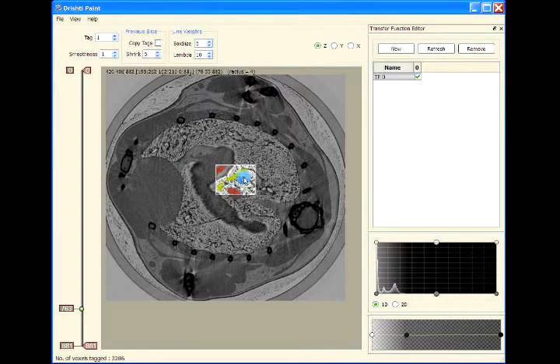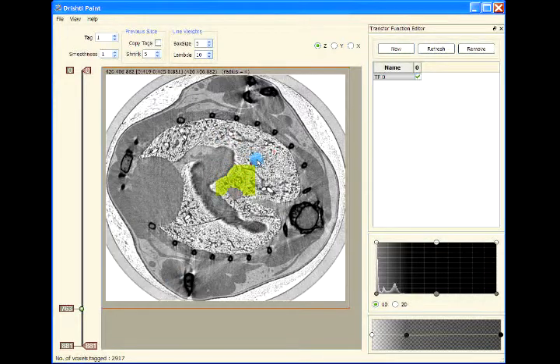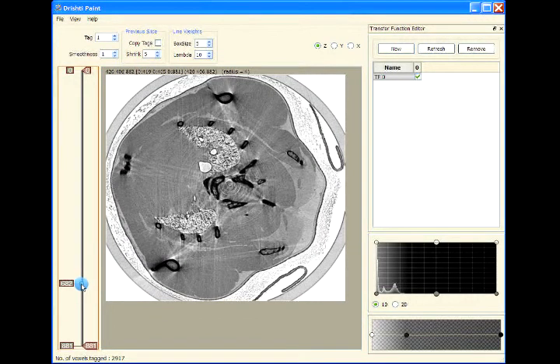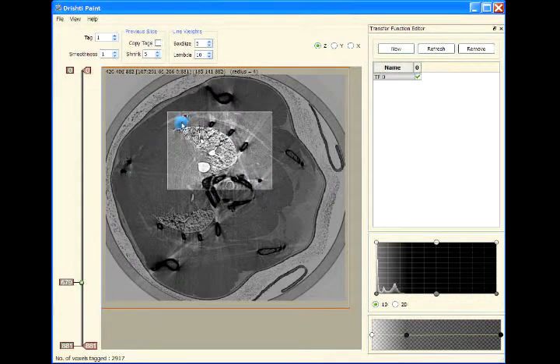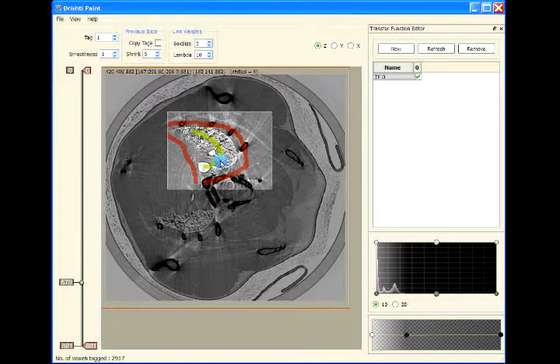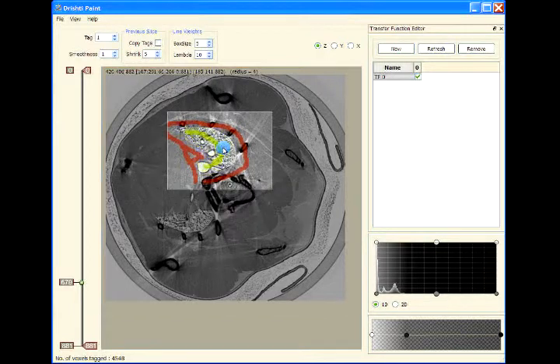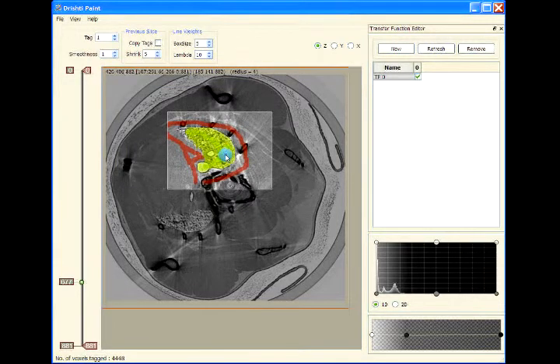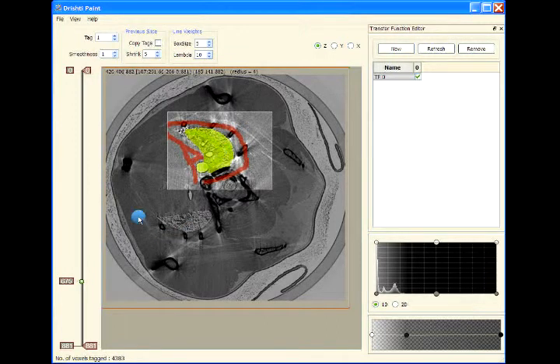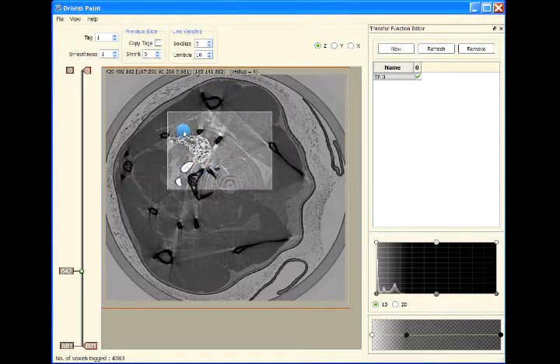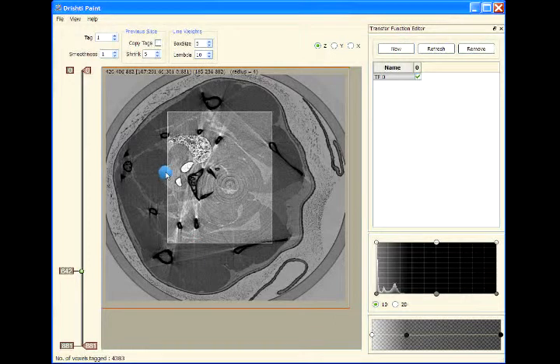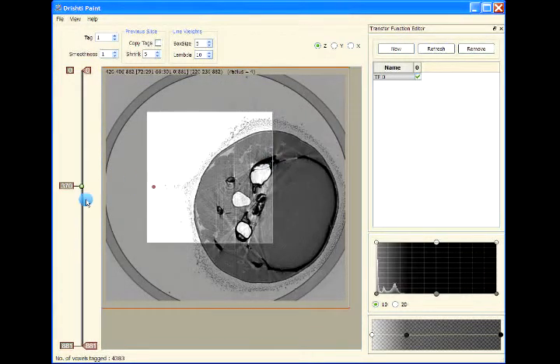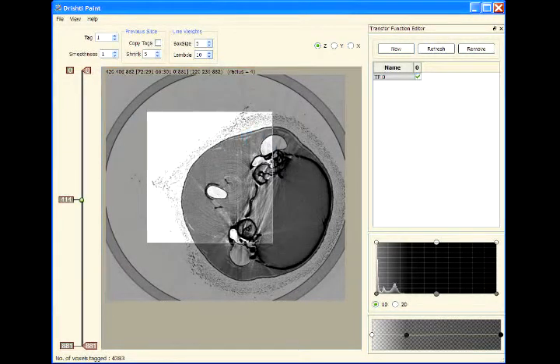That way I segmented this region by parts and then of course going back again here. So that is background and then apply tag here. And similarly on this side. And then we continue joining these airways right up to the nose. Let me show you the result now.